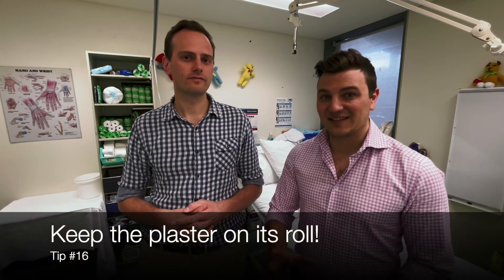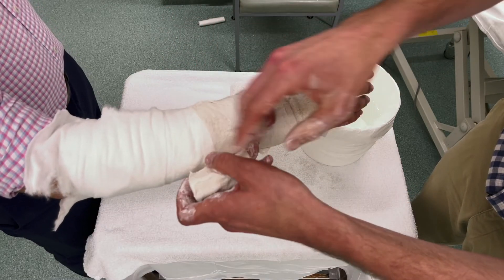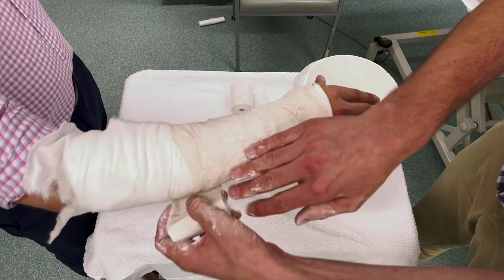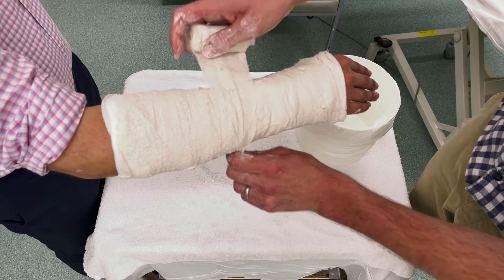For cylinder casts, a useful trick is to pinch both ends of the plaster roll and give it a twist before unrolling — this keeps the plaster cylinder from falling out of the roll. When going around contours of the arm to avoid dog ears, provide a bit of extra tension, then lay the plaster down rather than pulling it around and bunching it up. Many people have cone-shaped limbs, so this takes out the excess that would otherwise create bunched-up parts under the cast.